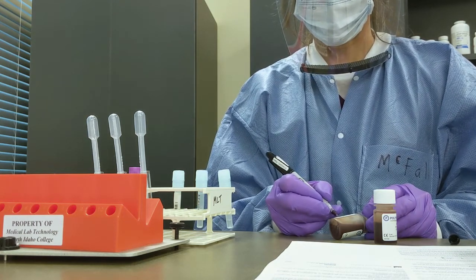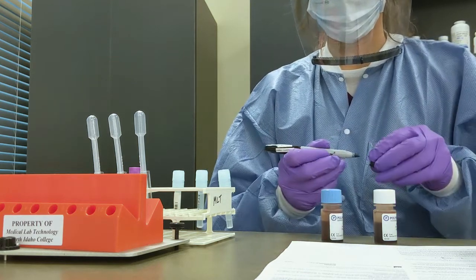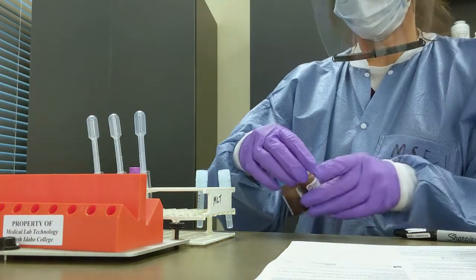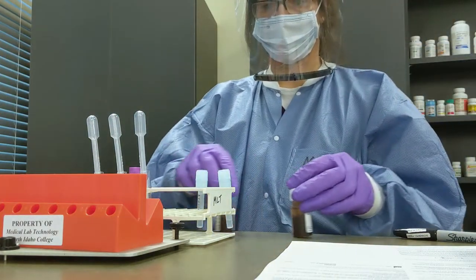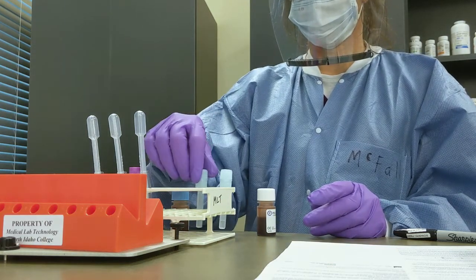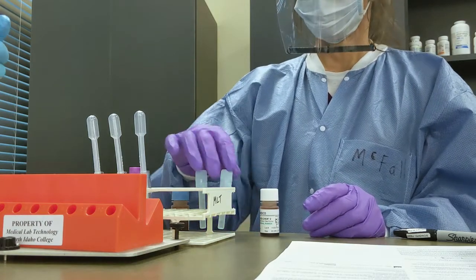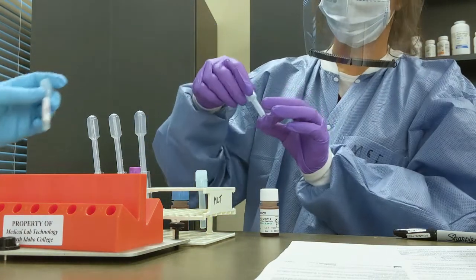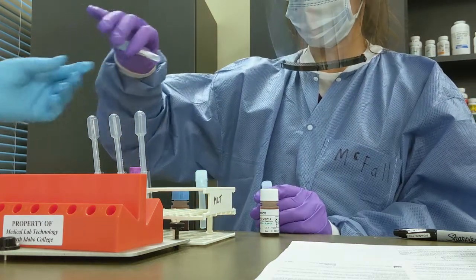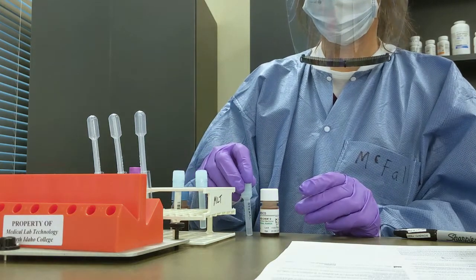Labeling is very, very important. When it comes to this particular method, you're going to find that reservoirs look slightly different depending on the manufacturer. In the bottom, you'll see a certain amount of sodium citrate. You need to label them, be very organized, and label the container on the outside.